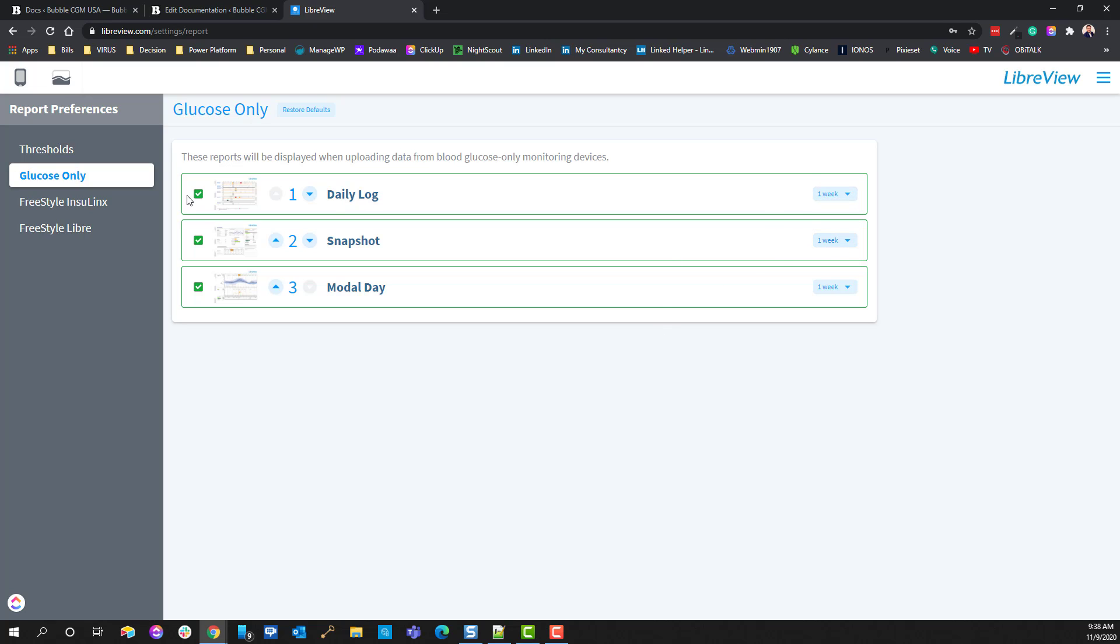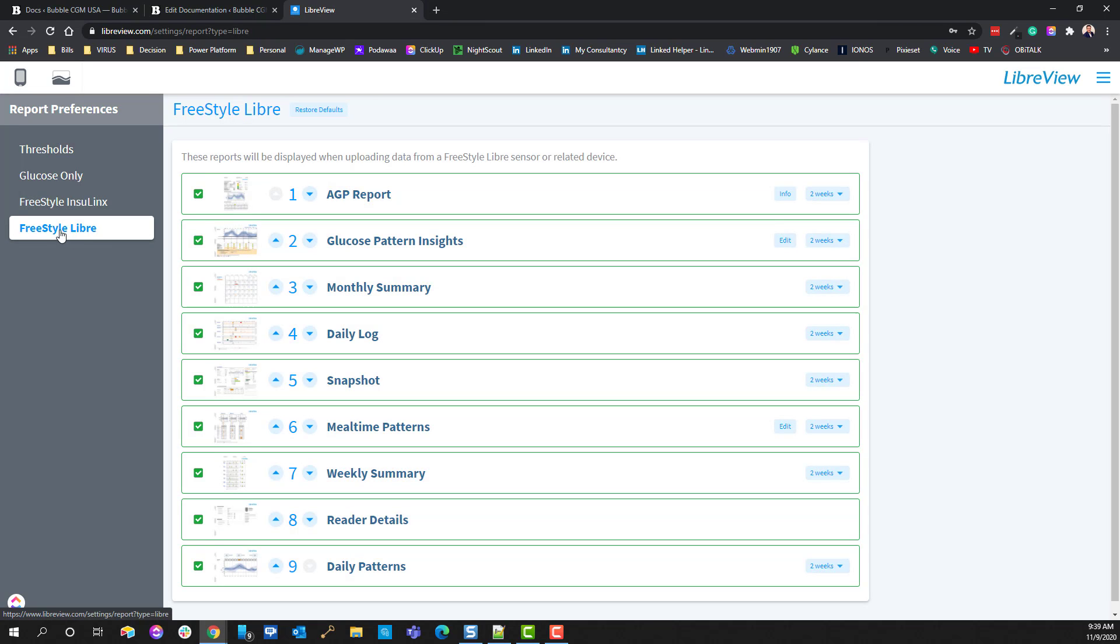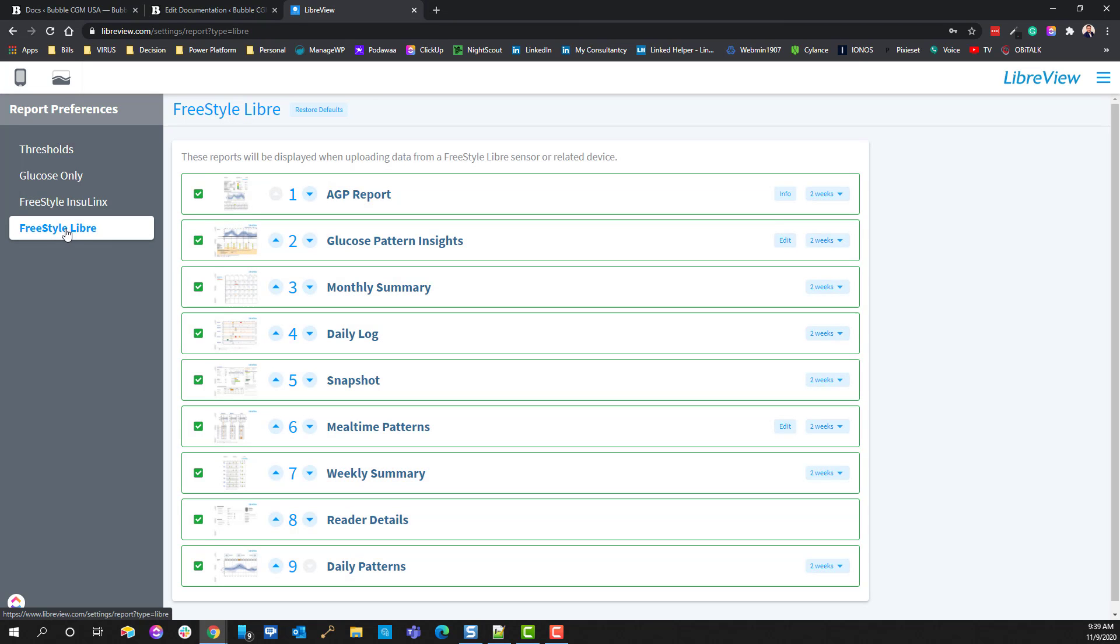And you can do that with each of these. Here is your Freestyle InsuLinx. I don't particularly have this one, but you can set up the settings for that. Here are additional settings for the reports with regards to the Freestyle Libre, which is what Diabox uses and what I use here.